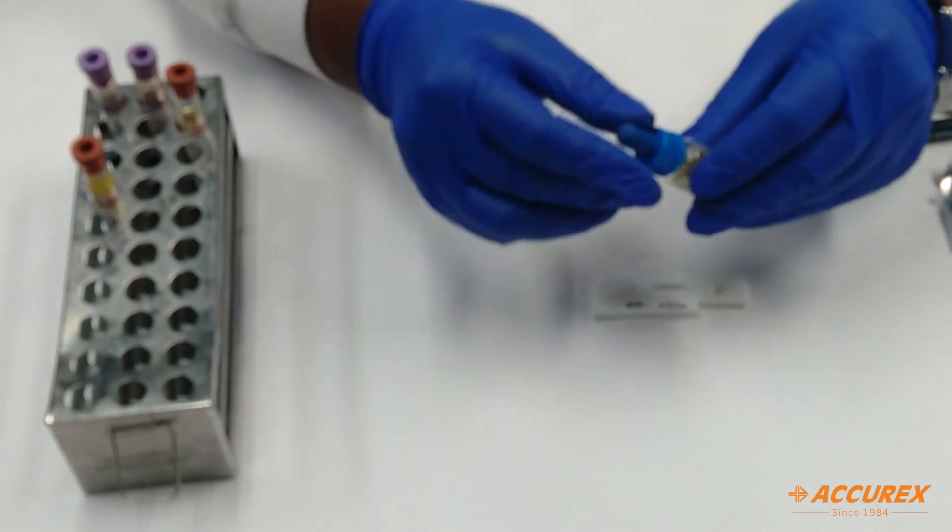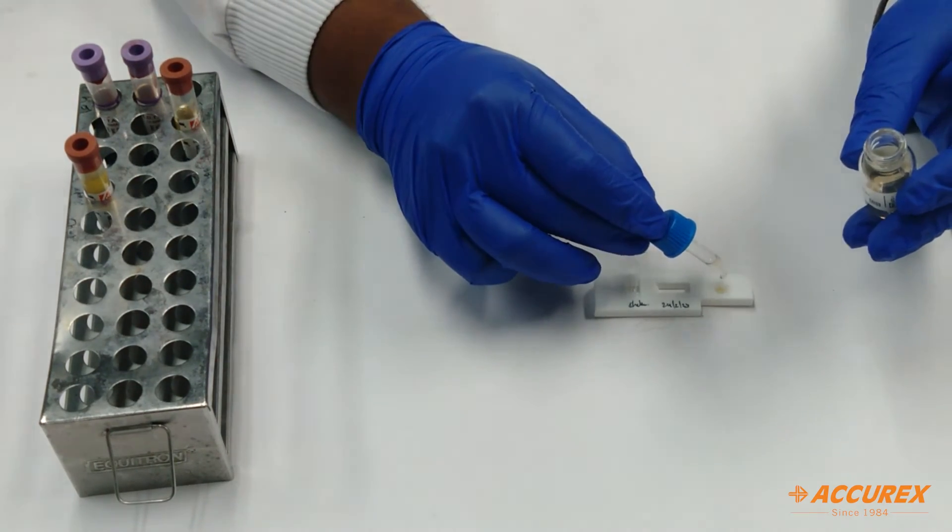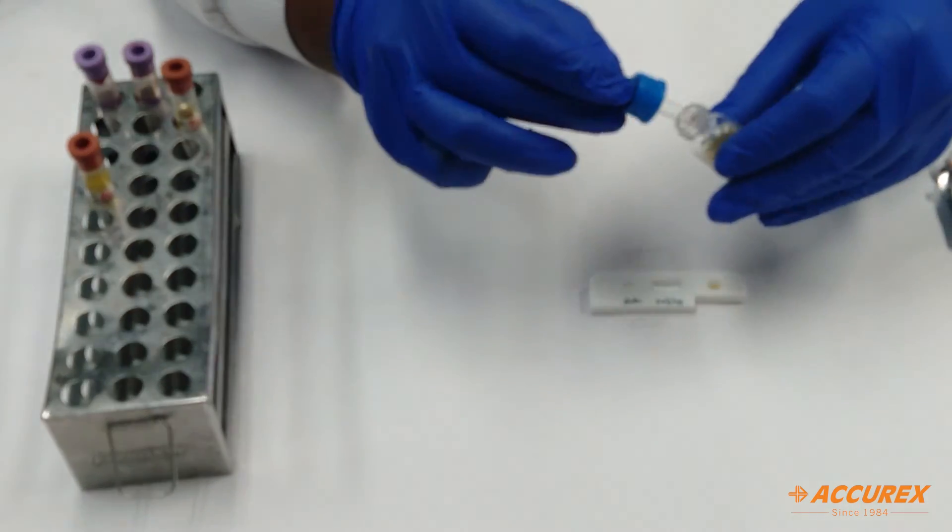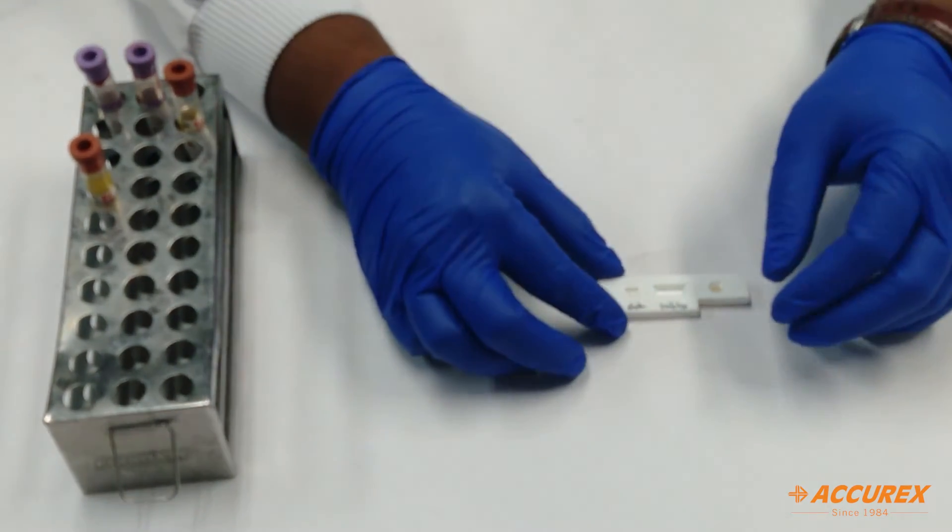Then you need to add two drops of buffer—one, two. The process has started.